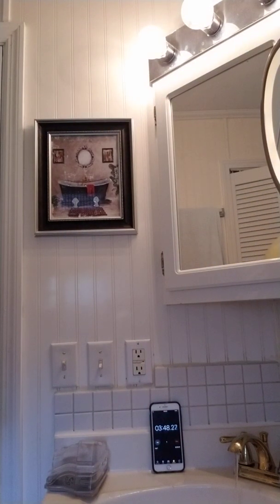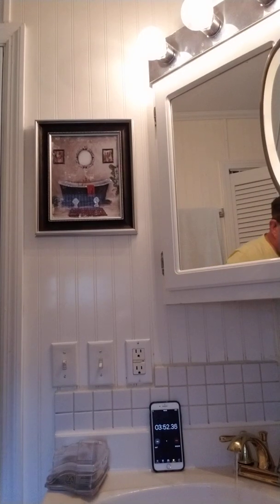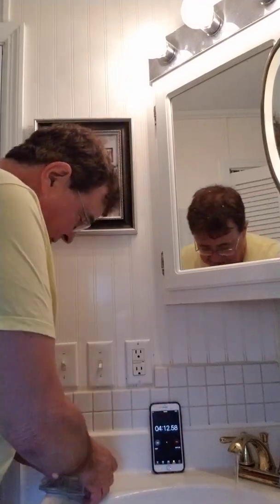Now, let me tell you something. During the day, these don't completely dry out, but really, it's all clean, fresh water, and it had soap in it, so there's no bacteria left in it to worry about. So if you just hang it up over the shower rod or something, and just leave it during the day, in the evening, there'll still be some dampness, and that doesn't hurt. I've been doing this for 1.5 years, and I've not had any infections.